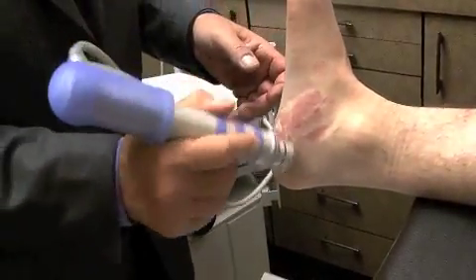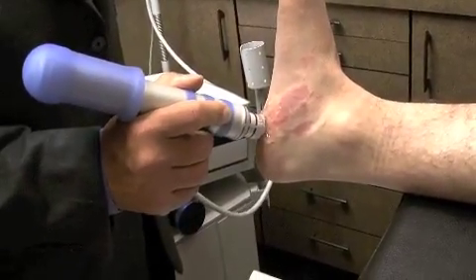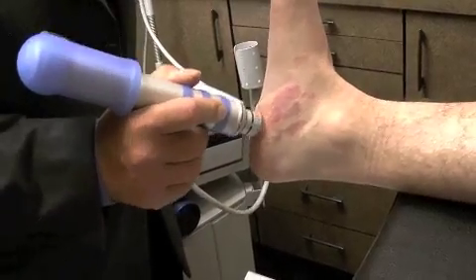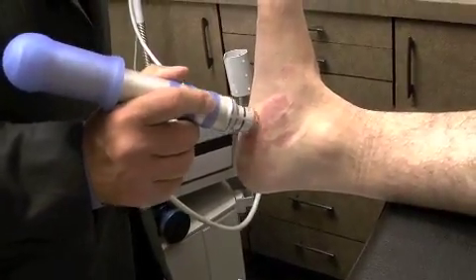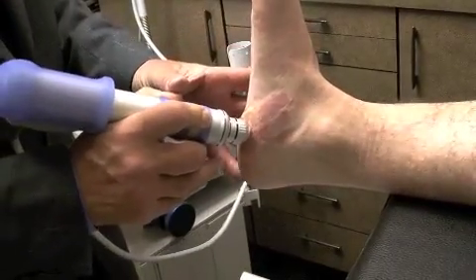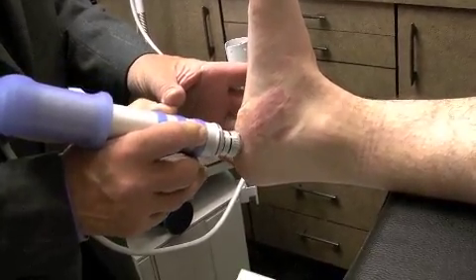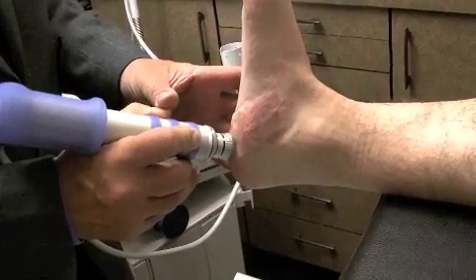So we'll start right in this area, and it's turned up all the way. We've got a nice strong volunteer here who's not going to have any pain with this. Okay, we're going to put this right on that area, and we move this around and go in a little circle like this.